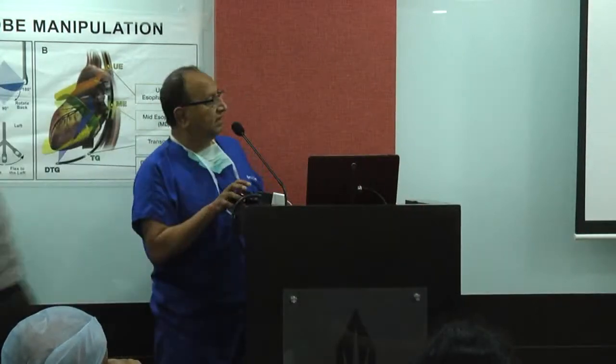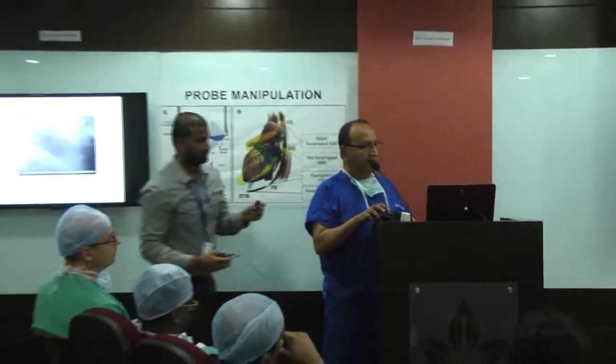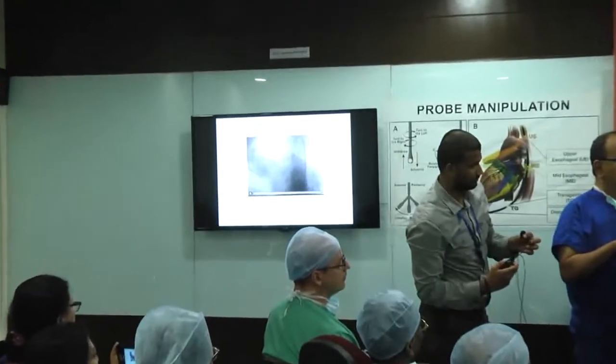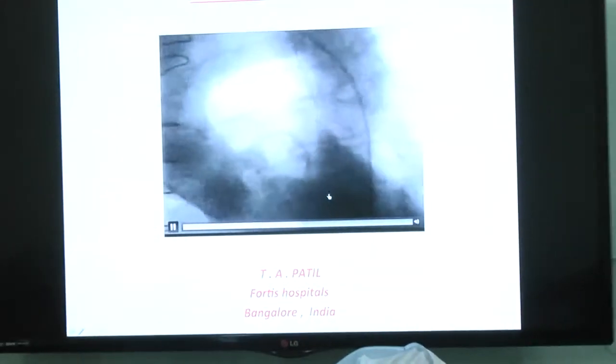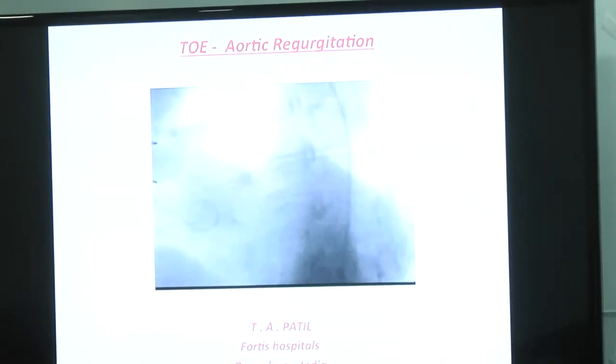Yeah, the first is actually a post coronary revascularization patient who has come back after 5 years with a severe aortic stenosis. My cursor is pointing towards a calcific aortic valve, which you can appreciate very easily, and you can see the dye coming back into the LV. There is a severe aortic regurgitation. It is a combination of both AS as well as AR.